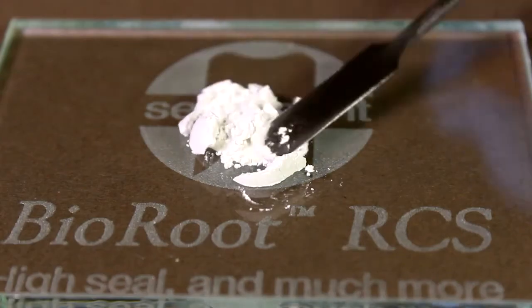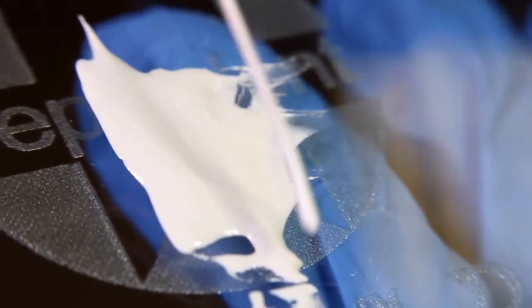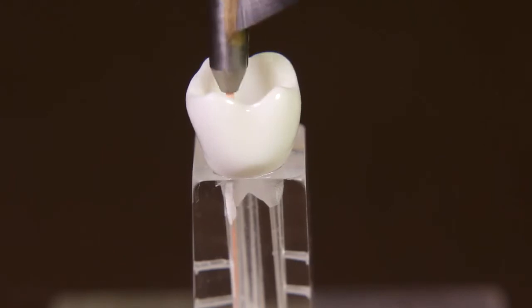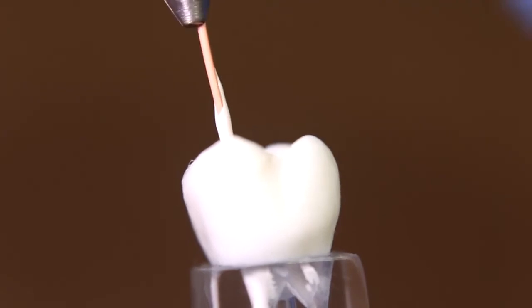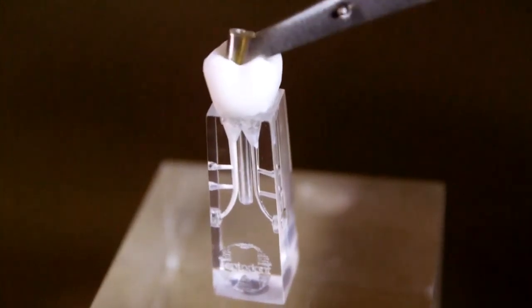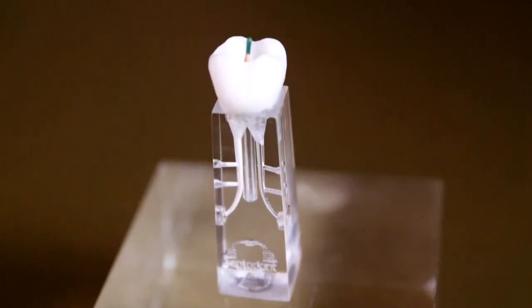Prepare Bioroot according to the instructions given. Apply a coating of Bioroot onto the canal walls using a gutta percha point. Complete the obturation by inserting the gutta percha master cone previously coated with Bioroot.